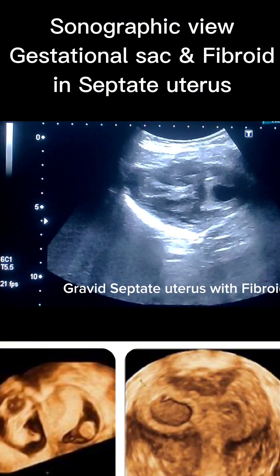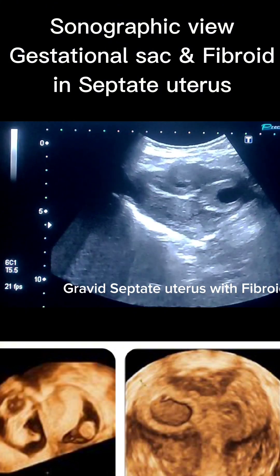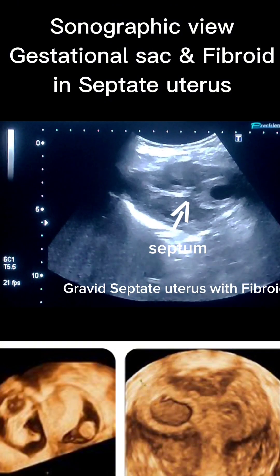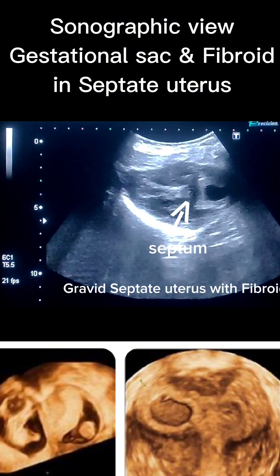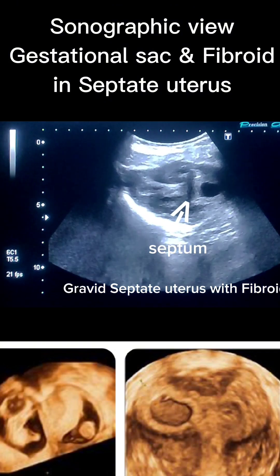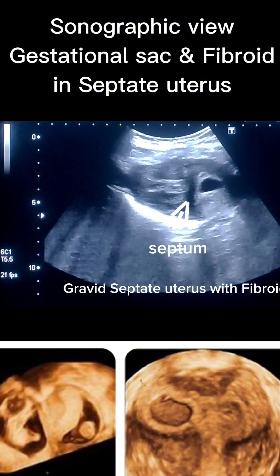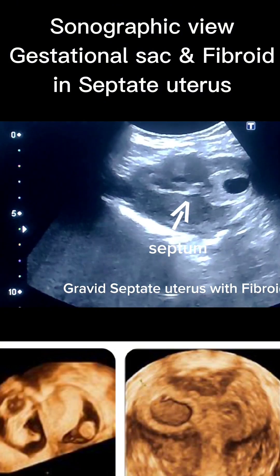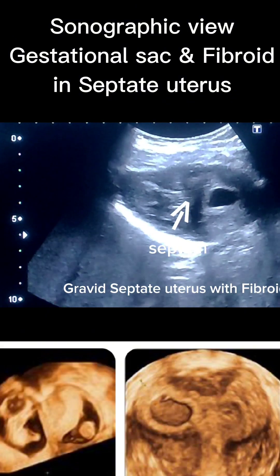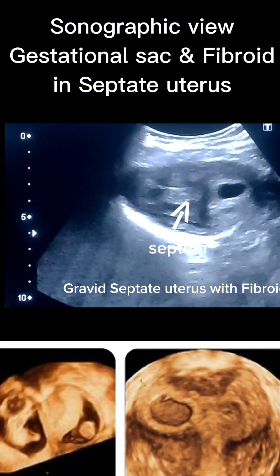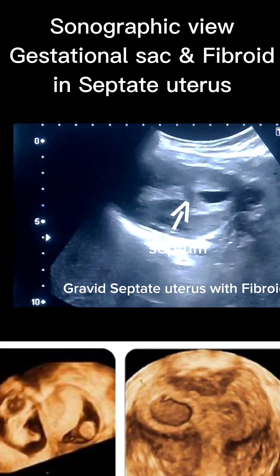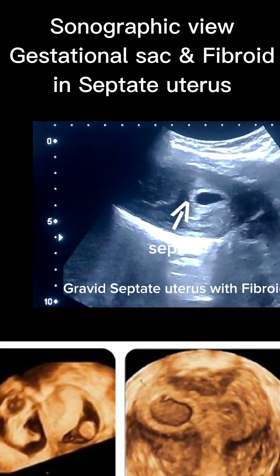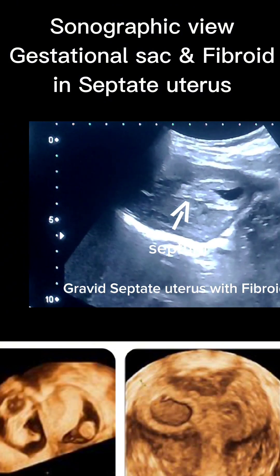On scanning, the uterus appeared abnormally shaped with a fibrous echogenic band running along the midline of the endometrial cavity, partially dividing it into two horns. This is a classic feature of septate uterus, a Mullerian duct anomaly and often implicated in recurrent pregnancy losses.